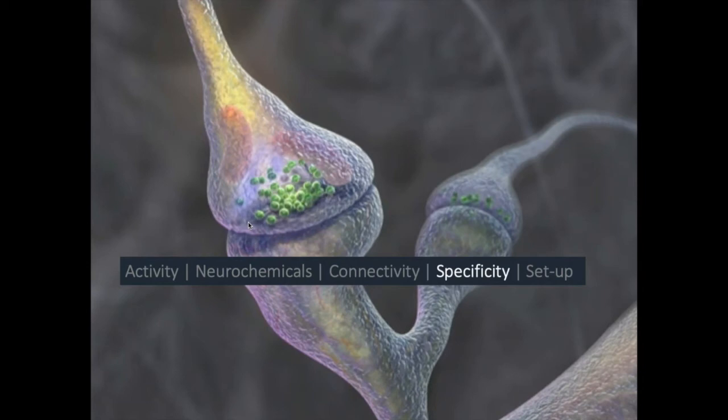Creatine is a good metabolite to use for healthy control studies. It's a marker of sort of cell energetics in general and sort of general cell health. So we don't expect it to change over 20 to 30 minutes of brain stimulation. And if it did, then we'd be quite worried. We've never seen it change. It changes with age, and it changes in neuropsychiatric diseases, but it doesn't change in young healthy people over a short period of time. You can calculate absolute concentrations, but you have to have very accurate water measures, and that can be slightly tricky, and I'm very happy to talk to people offline about that.